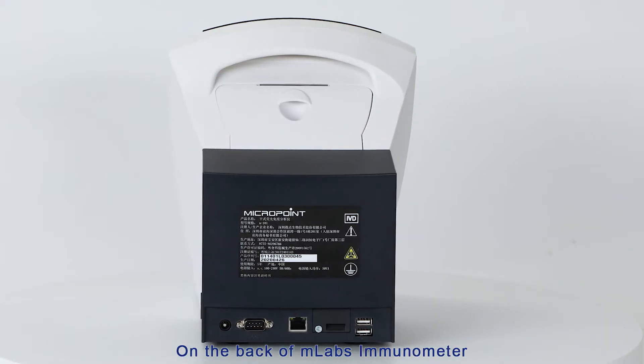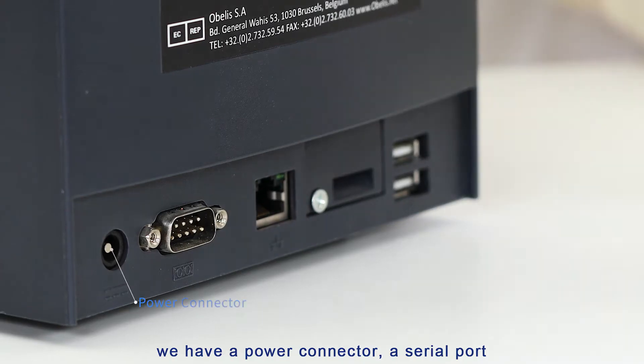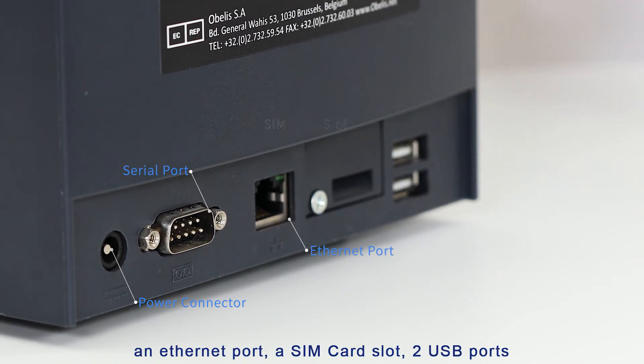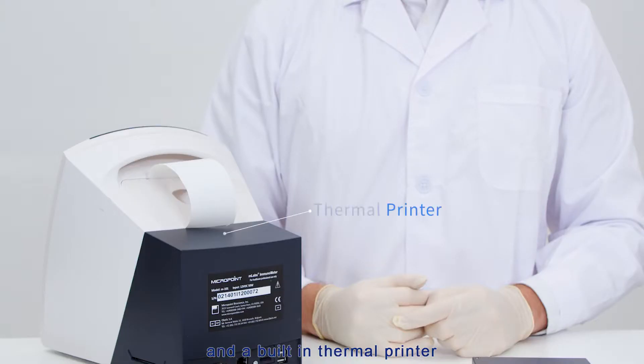On the back of the M-Labs Immunometer, we have a power connector, a serial port, an ethernet port, a SIM card slot, two USB ports, and a built-in thermal printer.